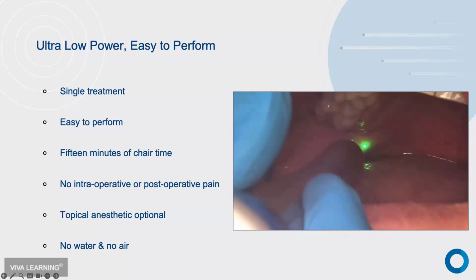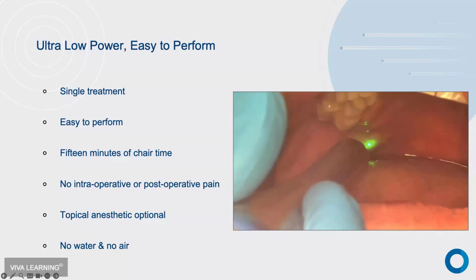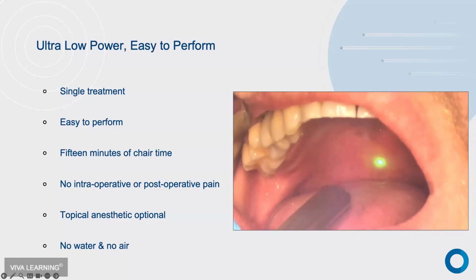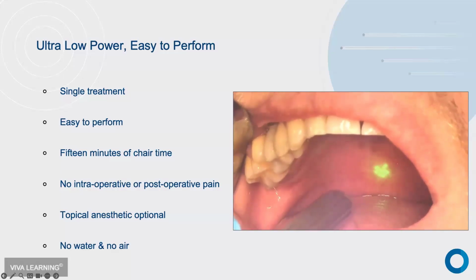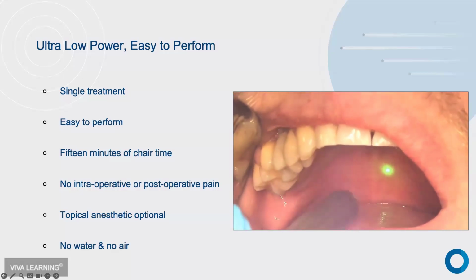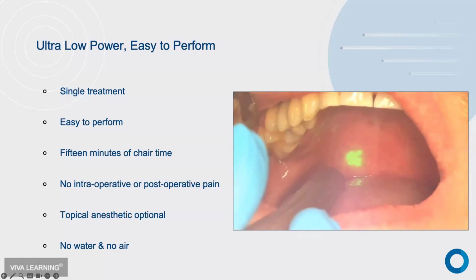So 15 minutes of chair time, one treatment time, and you're causing the palate to shrink up and actually contract and pull off the tongue. So you're improving airway. This is not treating sleep apnea. This is treating snoring and airway, but you're improving snoring just simply based on that. So incredible application for that.